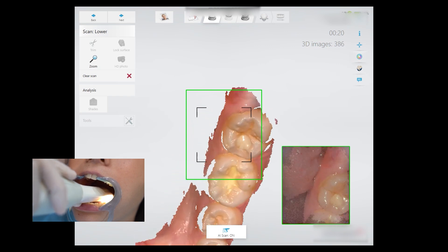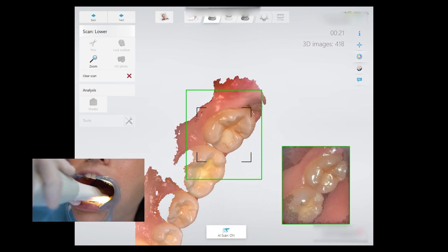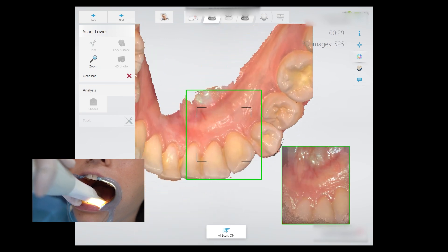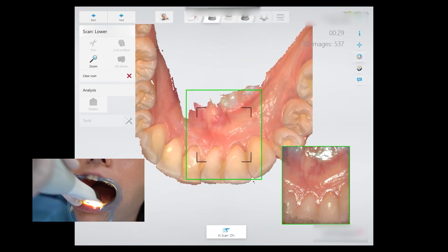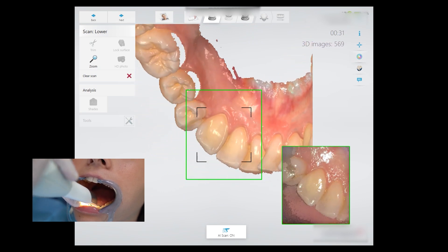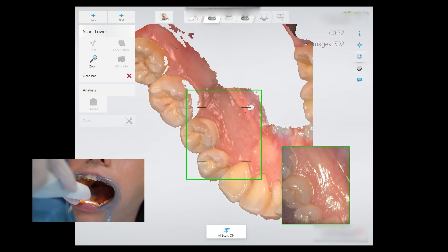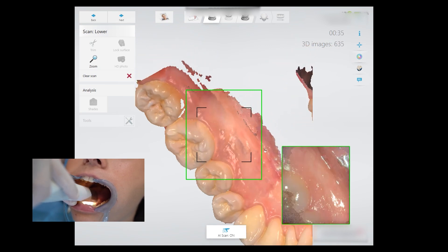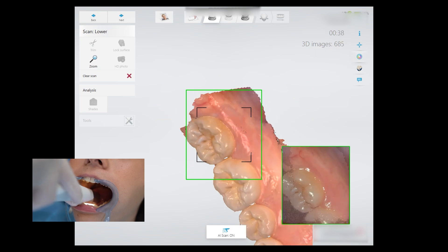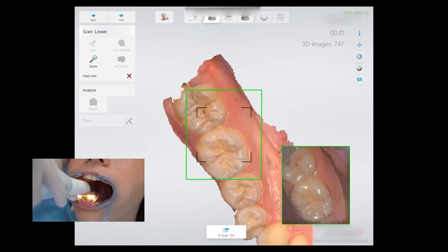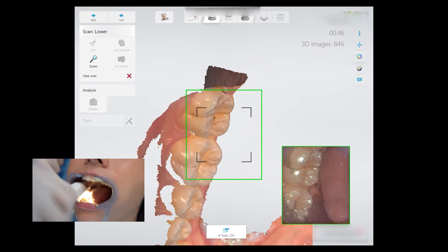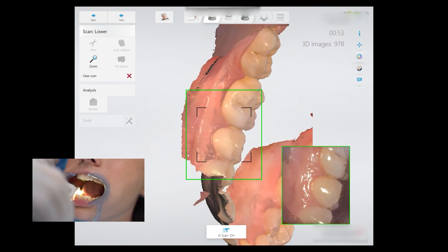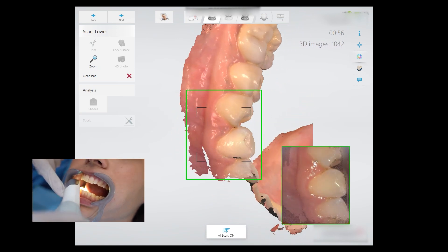Once you reach the terminal tooth, rotate the scanner to the lingual, keeping around 45 degrees tilt. Continue around the arch steadily, making sure you capture all the interproximal anatomy of the lingual surface. When the lingual is completed, rotate to the buccal surface with a rocking motion to capture the interproximal anatomy and go around the buccal surface from posterior to anterior, and the same for the opposite side.